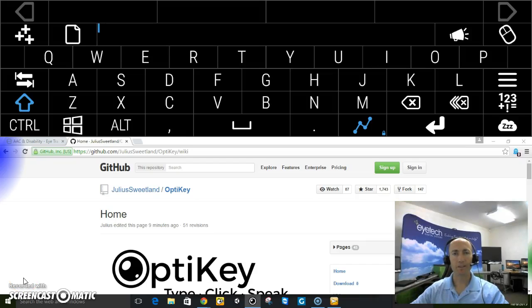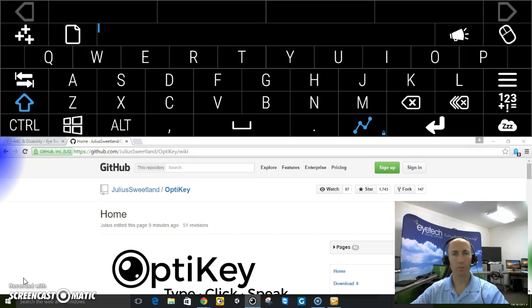Hi, my name is Keith Jackson with iTech. Today I wanted to show you a new on-screen keyboard called OptiKey. You can download it for free at OptiKey.org.